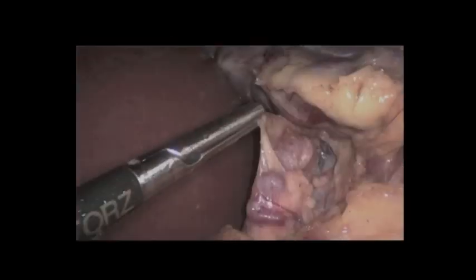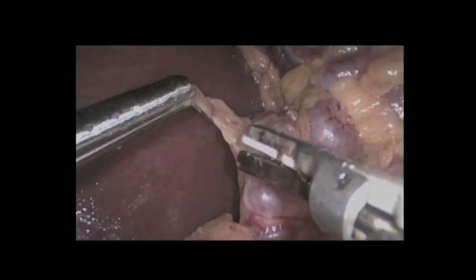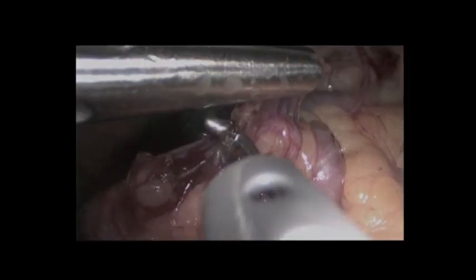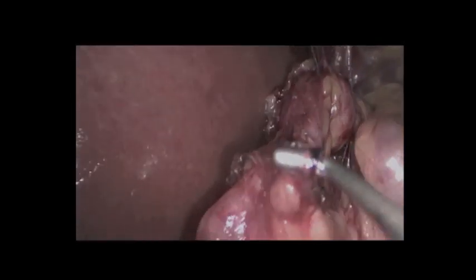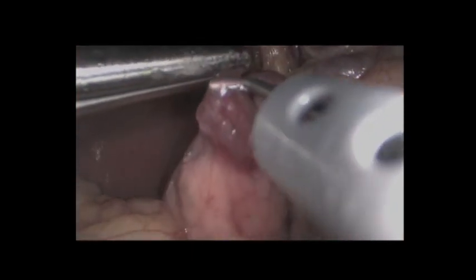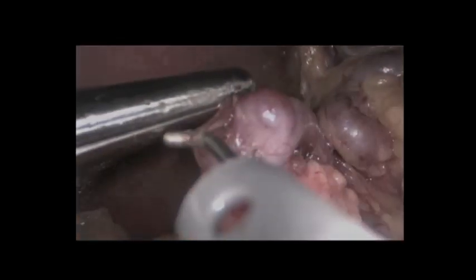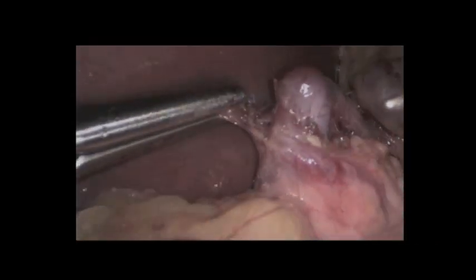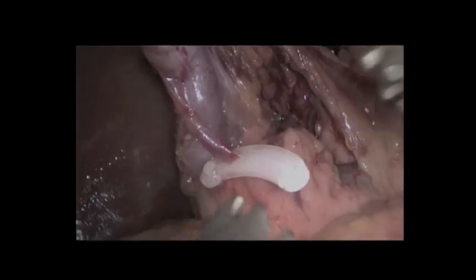So then the splenic artery was identified. And the dissection started with the harmonic scalpel and went down proximal using the hook, as you will see next. So the hook was used to isolate the splenic artery from the tail of the pancreas. As the artery was isolated, we realized that the splenic artery aneurysm was exactly there, and it's shown in the video. So then a small accessory splenic artery was identified, and it was clipped and divided with scissors.